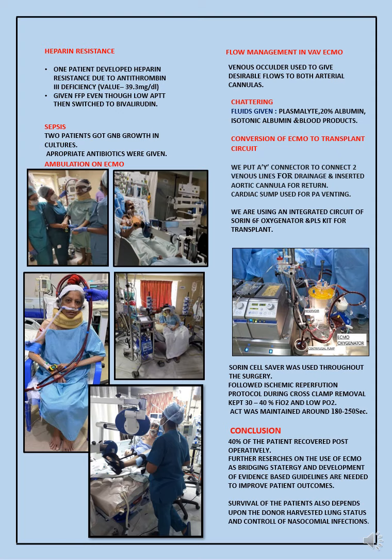We are using an integrated circuit of Sorin 6F oxygenator and PLS kit for transplantation. We put a Y connector to connect 2 venous lines for drainage and inserted an aortic cannula for return. We followed ischemic reperfusion protocol during cross-clamp removal.